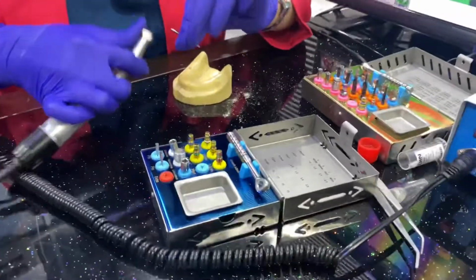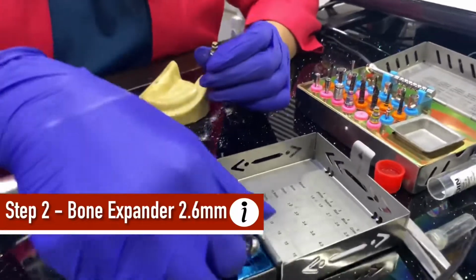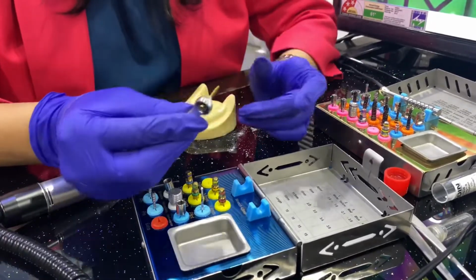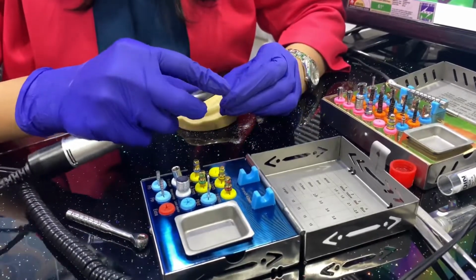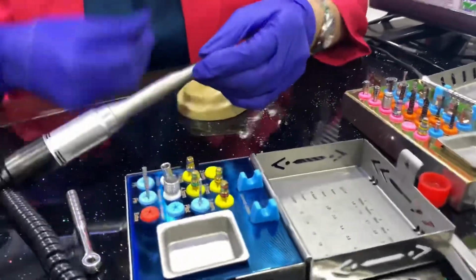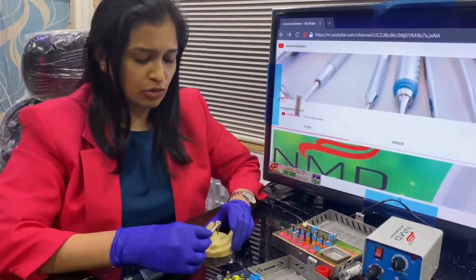After this, I will be using the expander. So you can use the expander in two ways. One is through a ratchet, you can expand it. Also, if you want to expand it using a handpiece, this is how you would attach it and use it. But what I would initially advise is that when you're doing your cases initially, I always prefer that hand control is better.